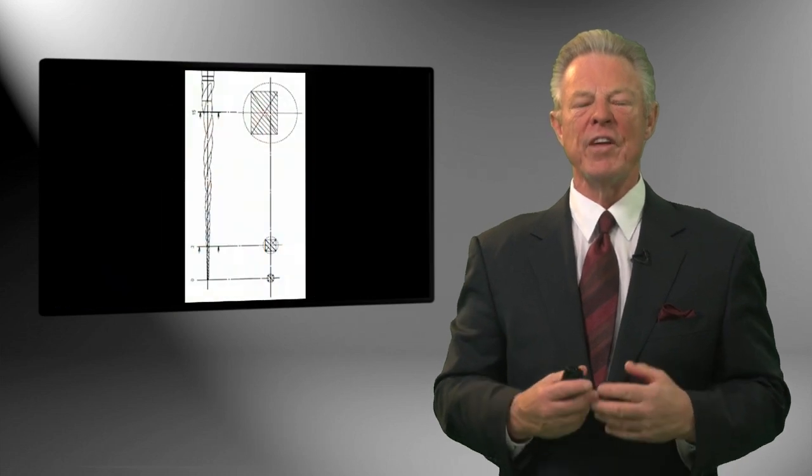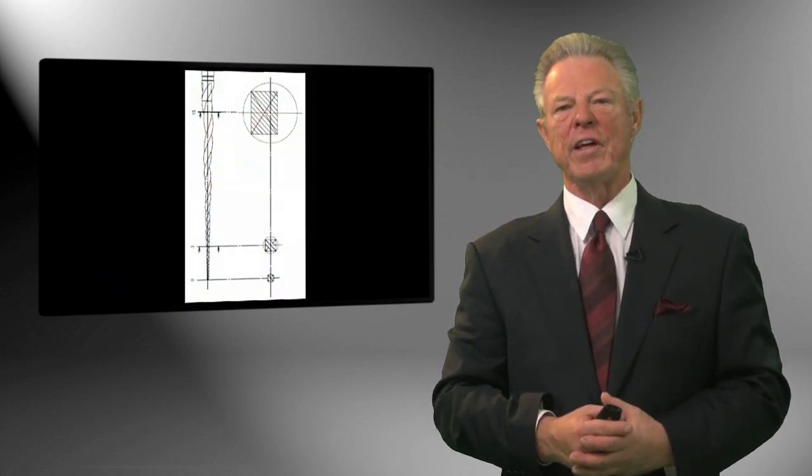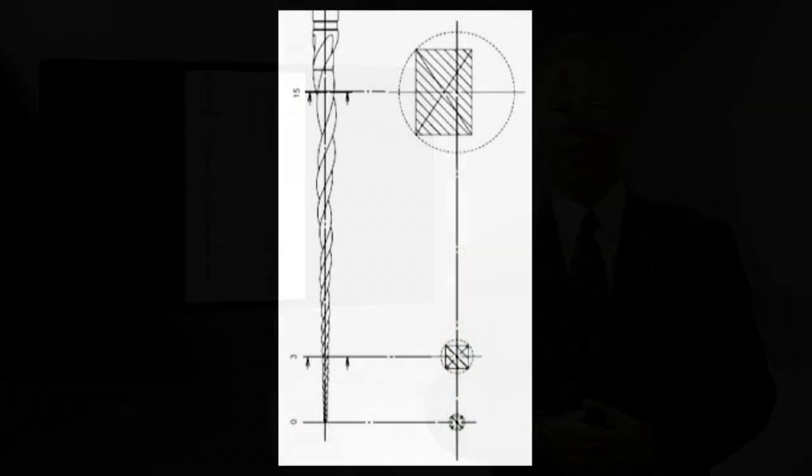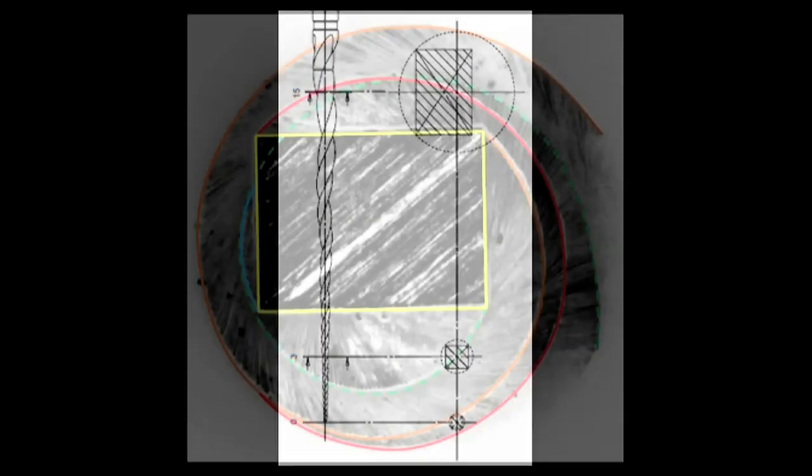And so this was one of the original work that Mike showed. And if you look at that circle in the top right, which is a cross section of the file on the left, you can see that this is a rectangle, not a convex triangle like ProTaper, as I'll show you in a bit, but a rectangle. But how the heck did it get over to the side? Well, by changing the central, offsetting the core. And then now let me explain.